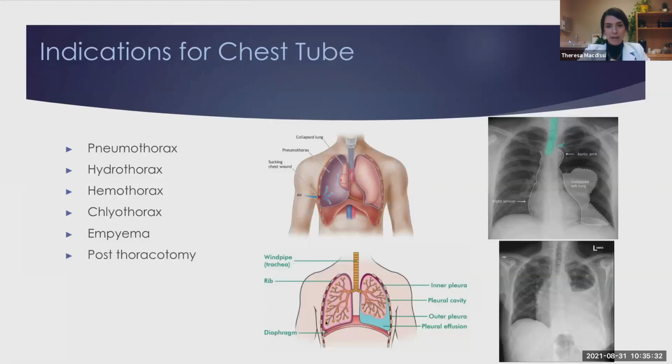And over here we have pleural effusion, so you can see pleural fluid is collecting around this lung area, and that's where you're going to put the chest tube in to drain it out. Here's a picture of a chest X-ray example of a pleural effusion. See how you can no longer see the cardiac outline or shadow. Instead, you get this nice line up here that's a fluid line.